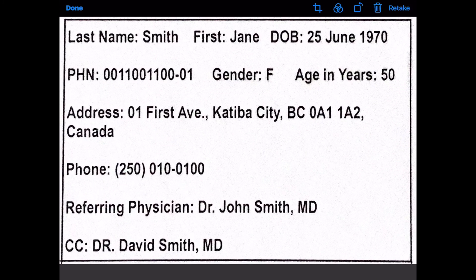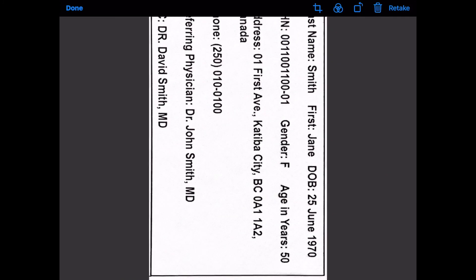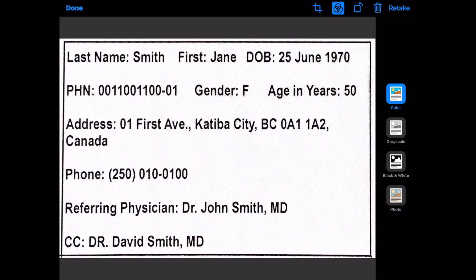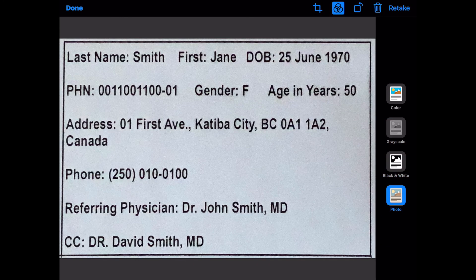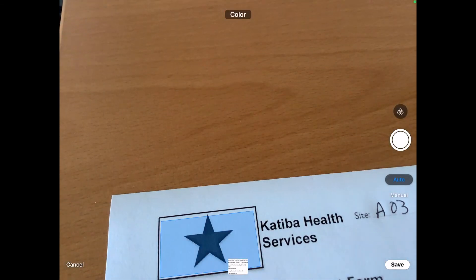Once you have tapped Keep Scan, you can adjust its orientation, cropping, and background lighting. Simply tap on the captured label and make the necessary adjustments, and then tap Save.